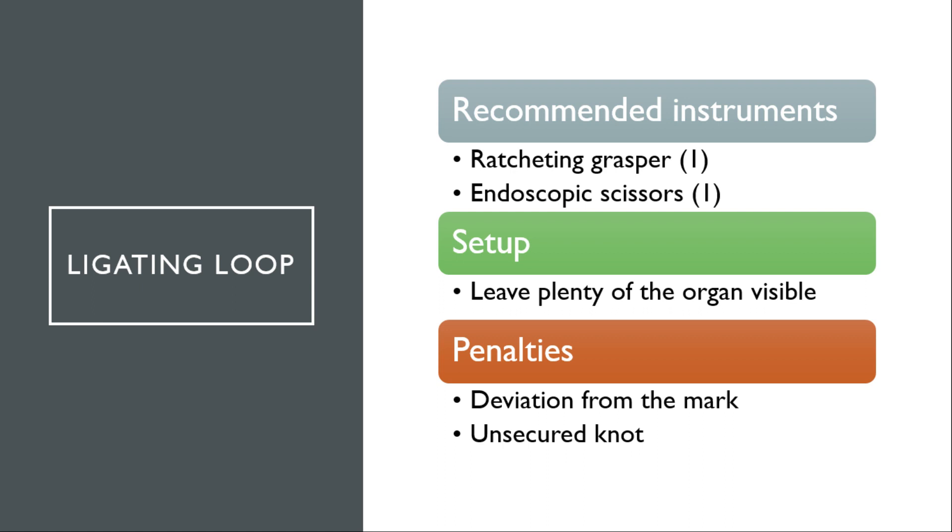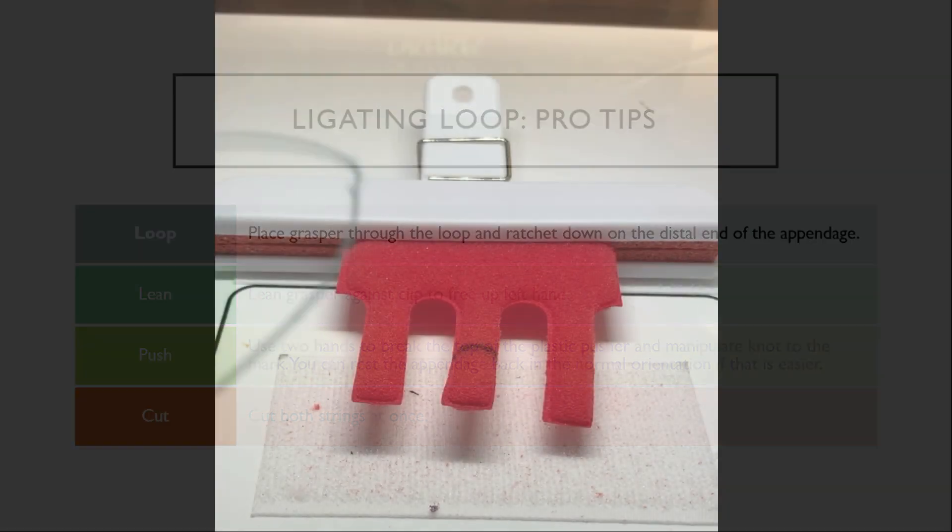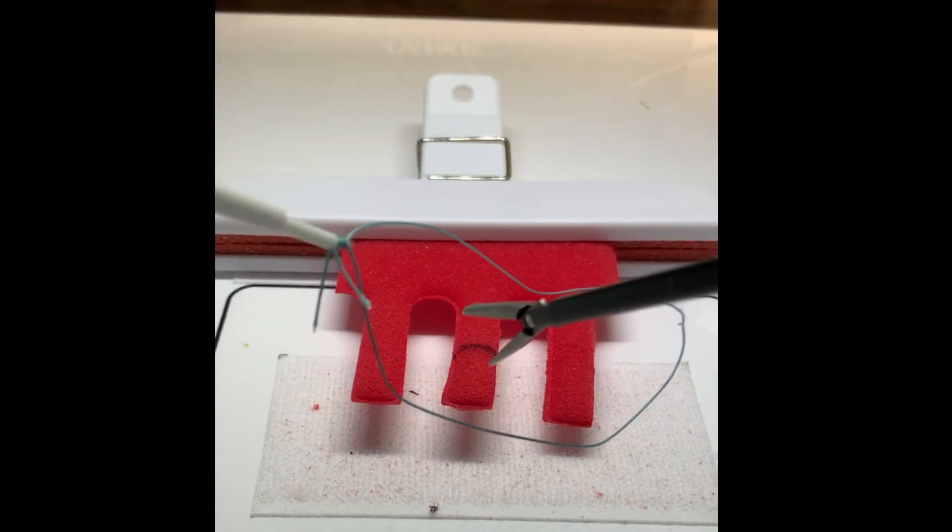For the ligating loop task, we actually recommend using a ratcheting grasper instead of a Maryland. In addition, you'll need laparoscopic scissors. Make sure to leave plenty of the organ visible in the clip and you will be assessed a penalty for any deviation from the mark or an unsecured knot. First, place your grasper through the loop and ratchet down on the distal end of the appendage as shown here.